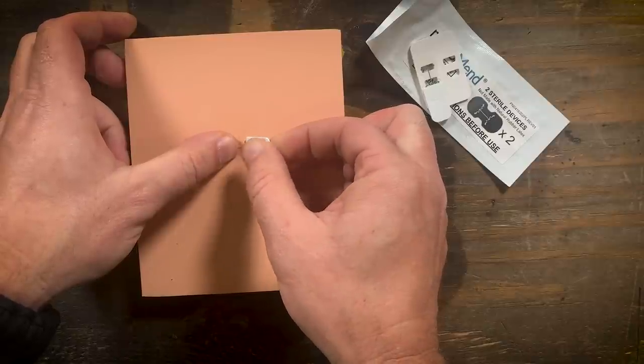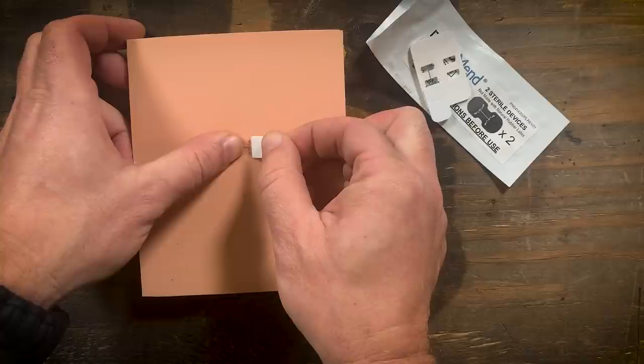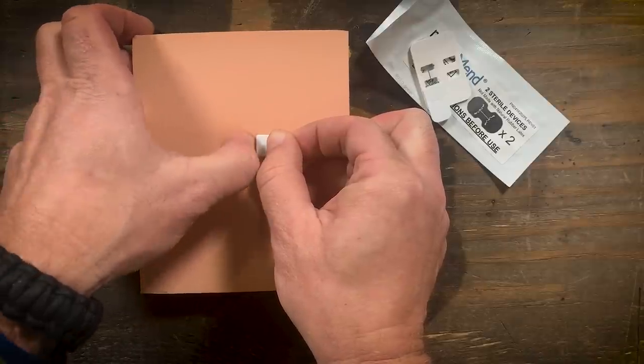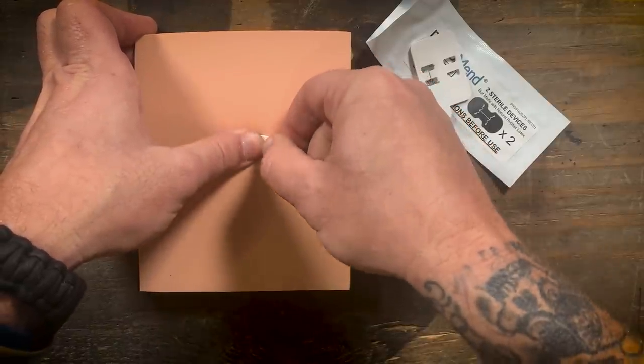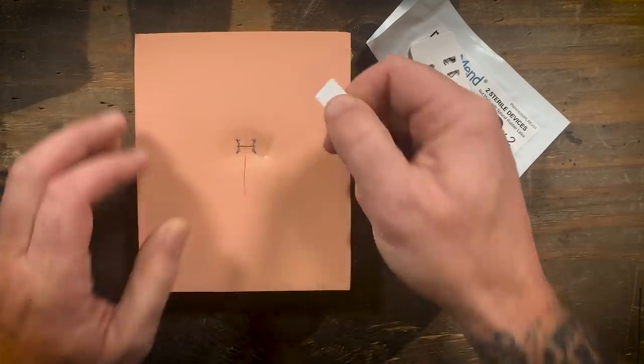Kind of helps hold those staples in and then you pull across some pressure to here and then pull that tab while keeping pressure on the other side.